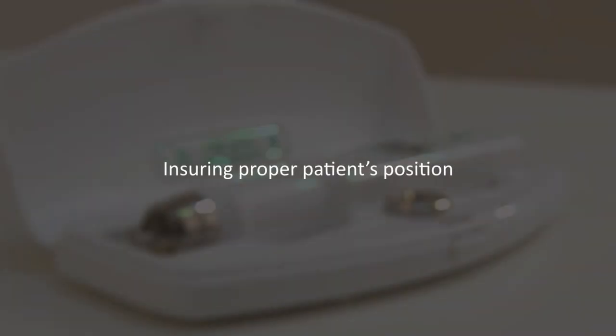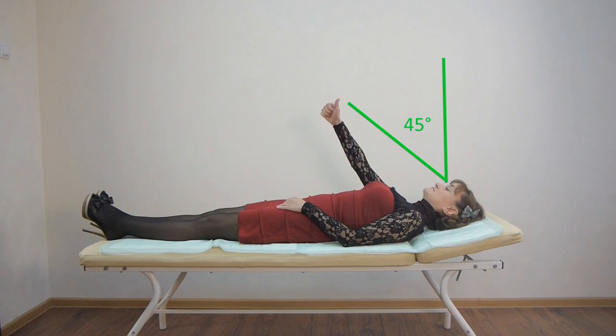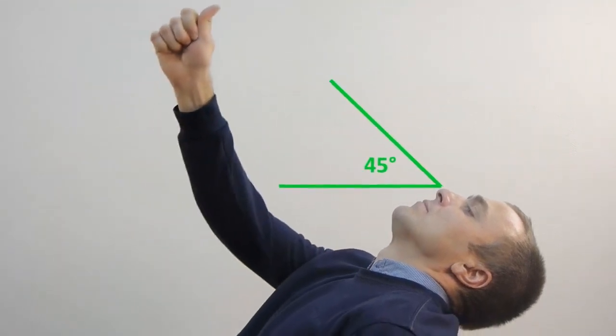How to do the measuring: ensuring proper patient's position. Patient's position is essential for accurate measuring results. To get the most precise measurements, you need to make sure that the patient's head is tilted back parallel to the floor. The eye gaze line makes up an angle of 45 degrees from an upright direction.